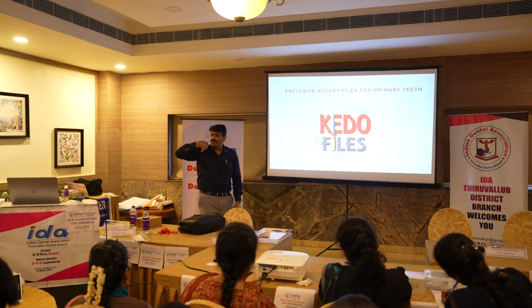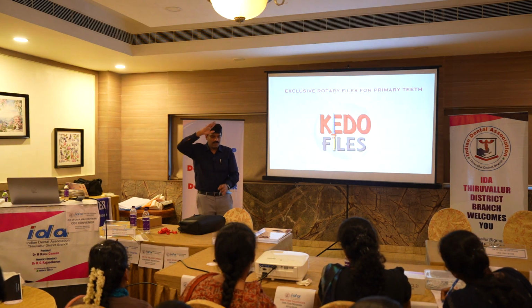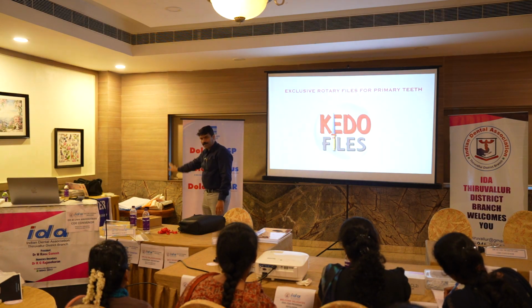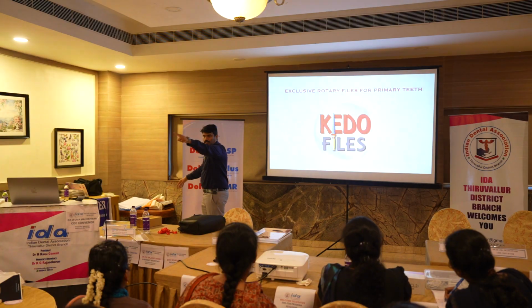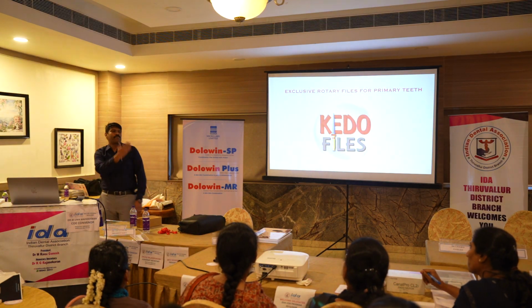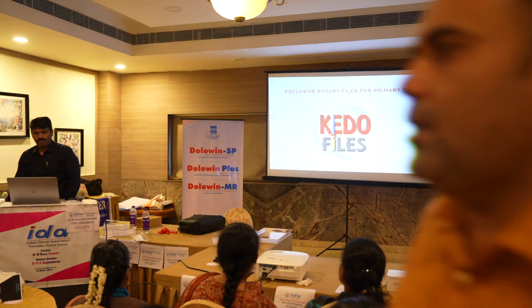Or away from the furcation region. Everybody will keep swiping around. You should always, for example, this is mesiobuccal axis opening. This is your furcation region. Go away and swipe. Don't come in. Am I clear?